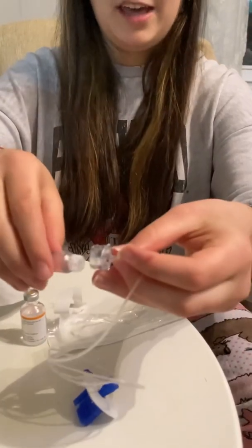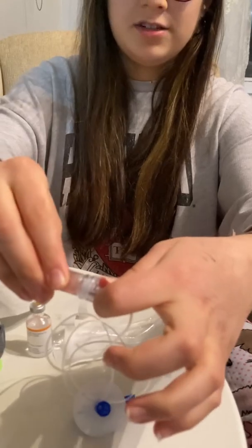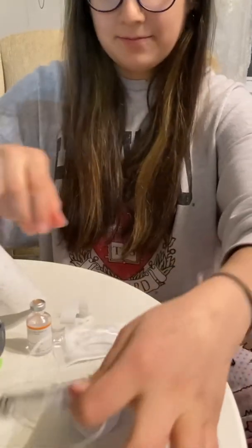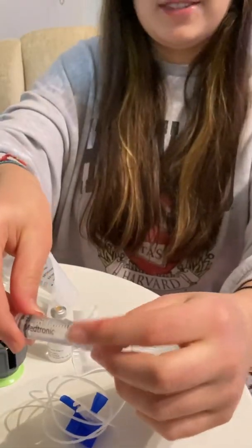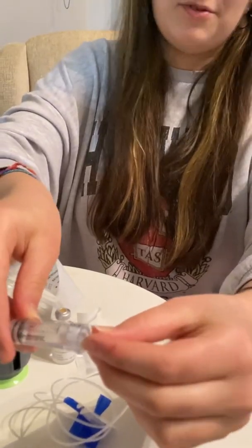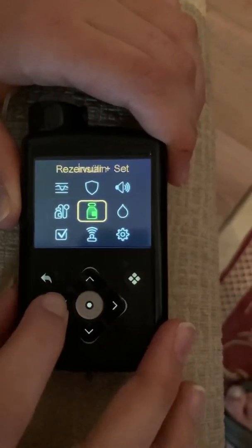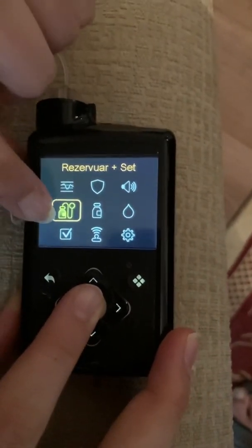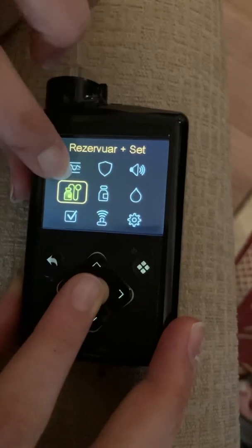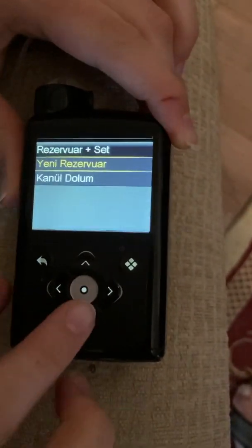Now I open the cable and connect it with the injector. You have to sense the click sound to be sure it's connected properly. Then you press this button and slide here, and you'll see the insulin with the infusion set symbol.